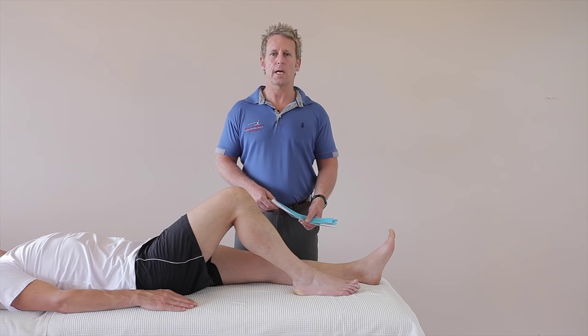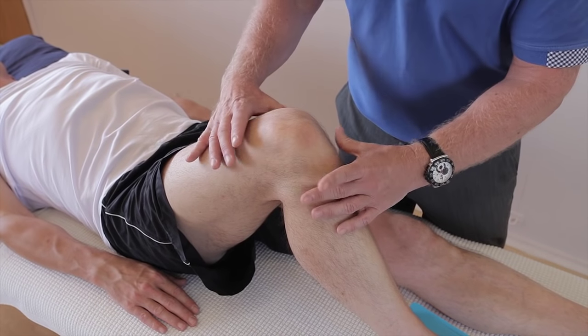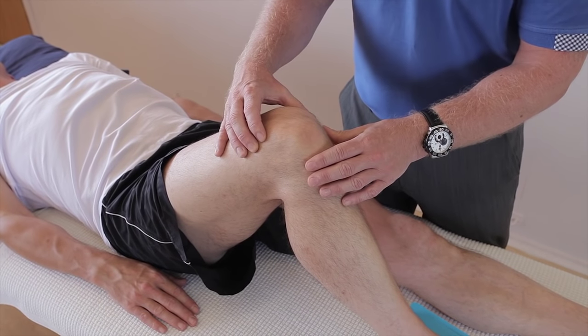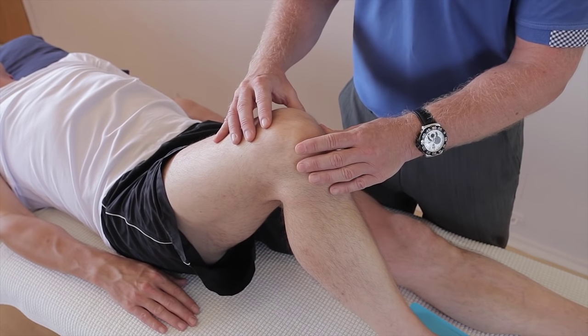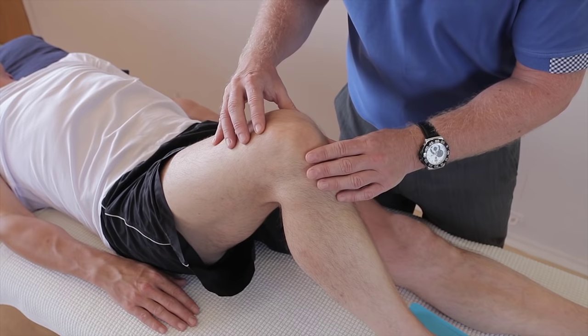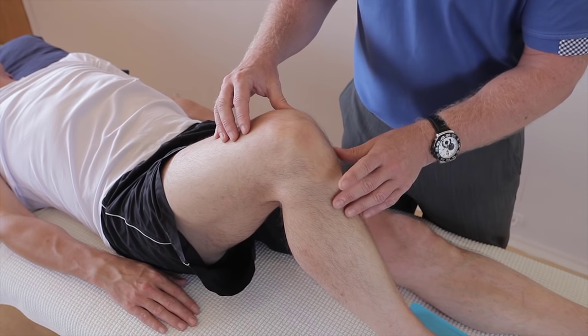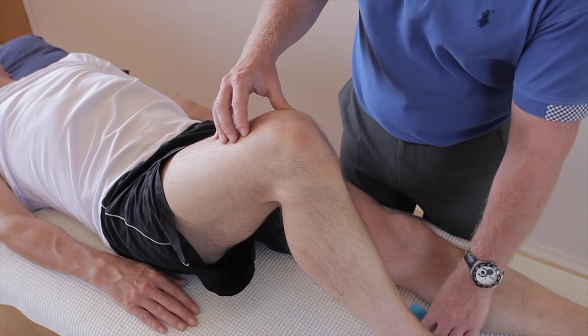In this video, we're going to look at a taping for edema and bruising for the knee joint. Patients that present with a knee that's very swollen is either synovial effusion or can actually be known as a haemarthrosis. One needs to decide on exactly what's causing the pain, but in terms of trying to reduce the swelling, we can actually use kinesiology tape and it works very well.